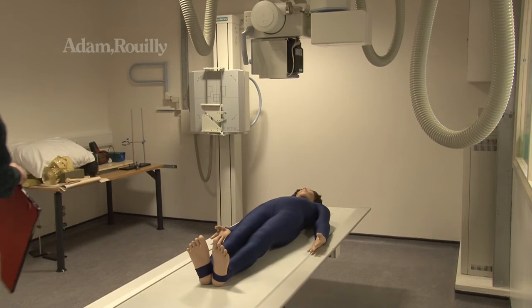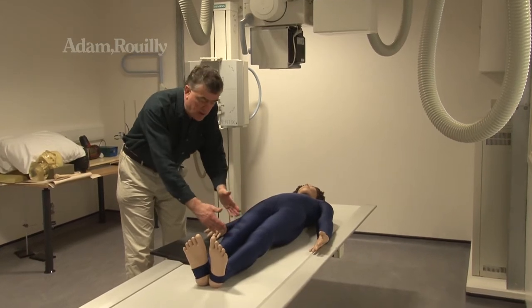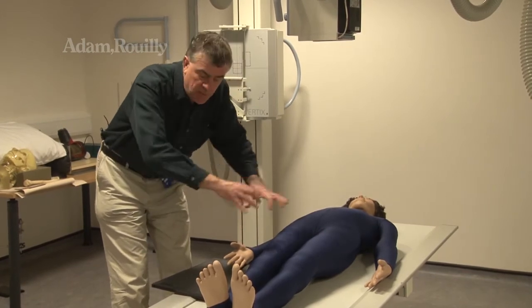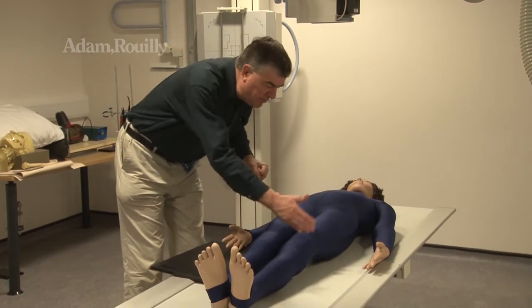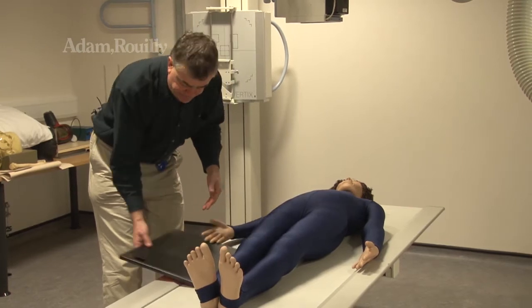Right, and now we're off to do the knees. Not just the knee joints, but of course we're going to include as much of the lower femur and as much of the upper tibia and fibula as we can, because we're not just looking at the joint space, but we want to make sure the alignment of the bones is okay. So again, we will get overlap to make sure that the upper femur that was included on the previous view links on with what we're taking here.